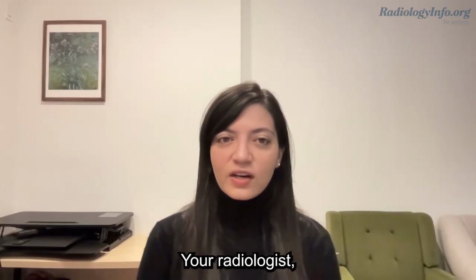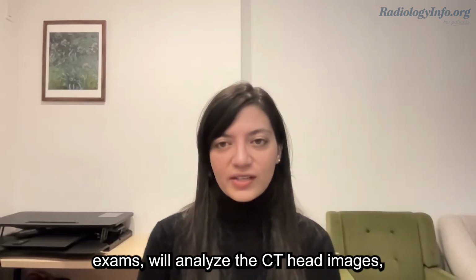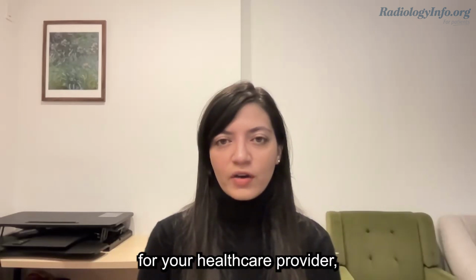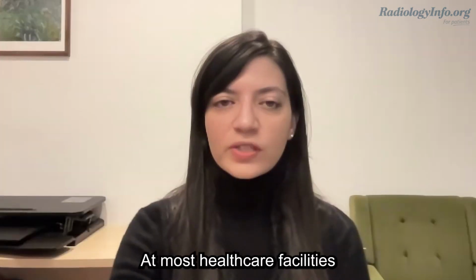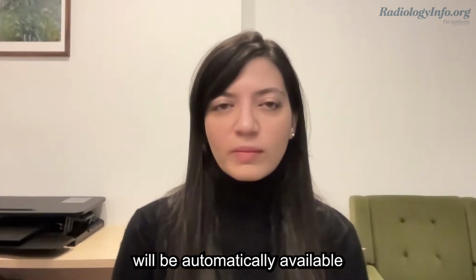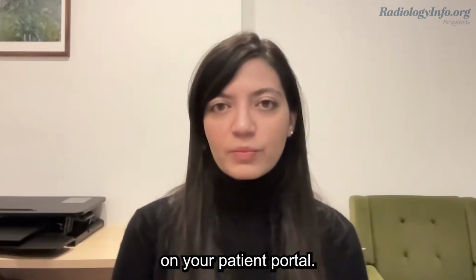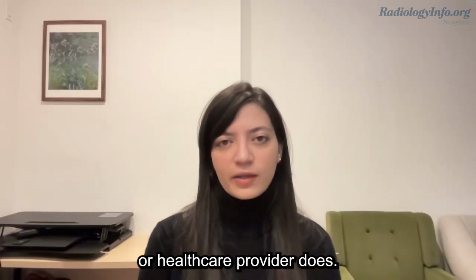Your radiologist, a doctor specially trained to supervise and interpret radiology exams, will analyze the CT head images and write a report for your healthcare provider, who will then discuss the results with you. At most healthcare facilities in the United States, your radiology report will be automatically available on your patient portal. You may end up seeing the report before your doctor or healthcare provider does.